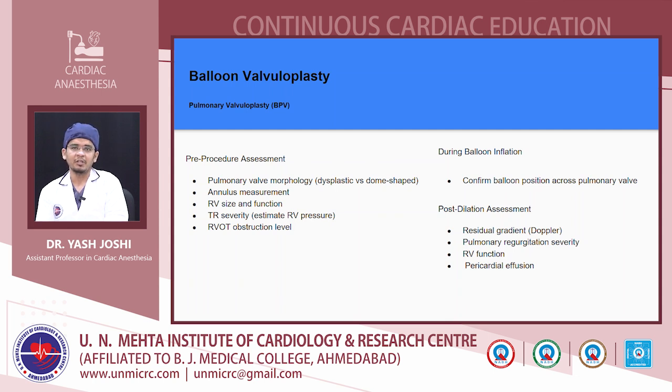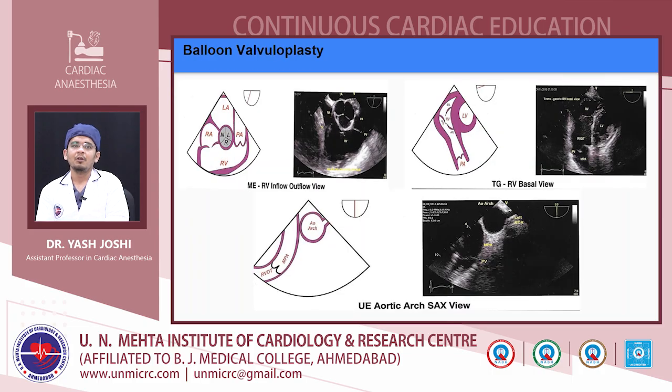During balloon inflation, it is helpful to confirm the balloon position across the pulmonary valve. Post-dilatation assessment covers residual gradient, pulmonary regurgitation severity if any new onset, RV function, as well as pericardial effusion.